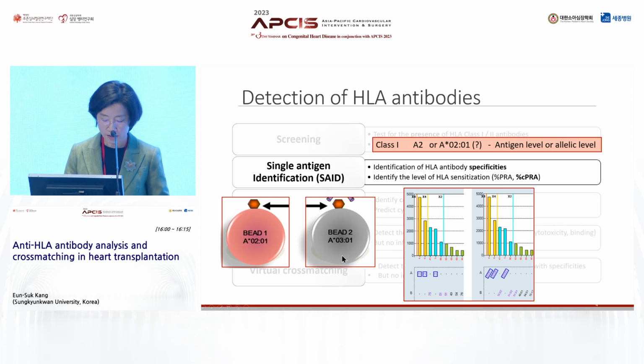When specific beads show a positive fluorescence signal, we can have the information about the targeted HLA specificities, not only in antigen level, but also in allelic level.